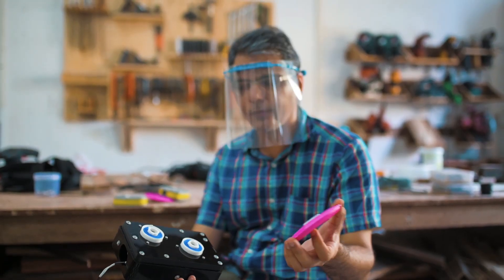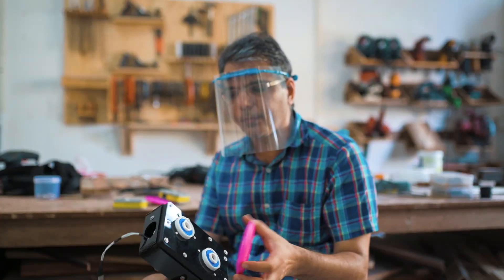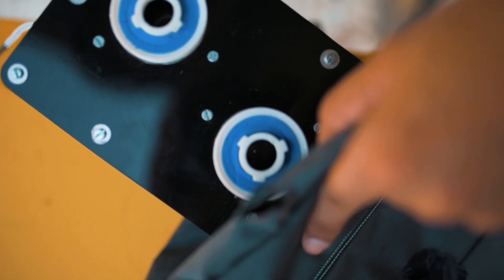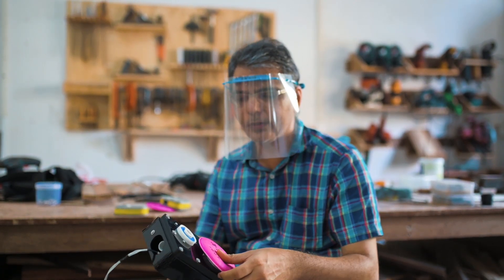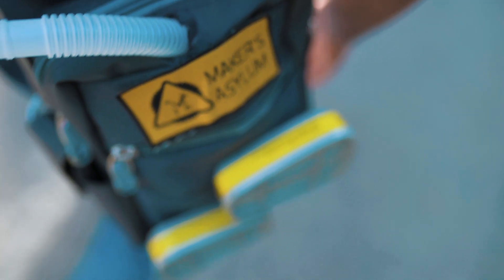And because the filter media is replaceable, it's very easy to swap it out at the end of your shift and just put in a fresh filter and you're good to go. So essentially the device lets you quickly doff and don your PPE suit without wasting too much time and get the job done.